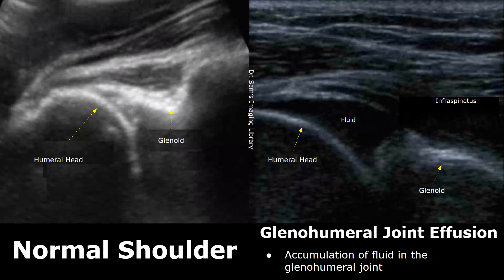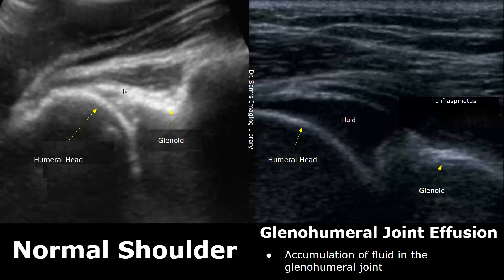This image shows us the glenohumeral joint. This is the glenoid, which is the lateral part of the scapula where the humeral head attaches. And over here we have glenohumeral joint effusion.